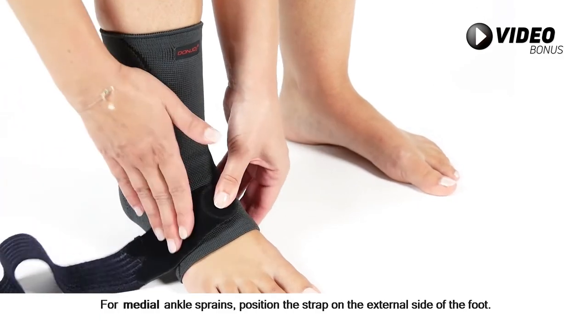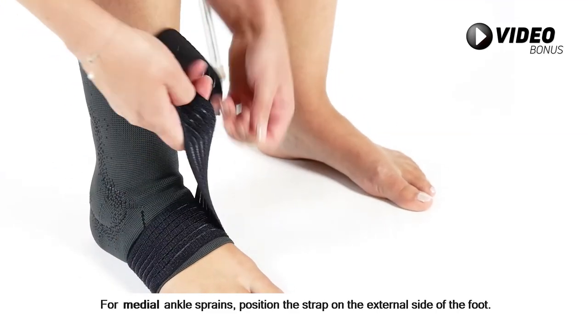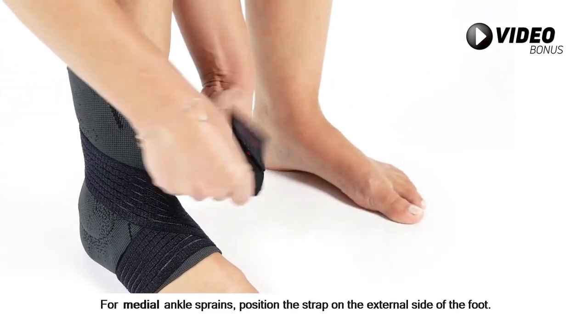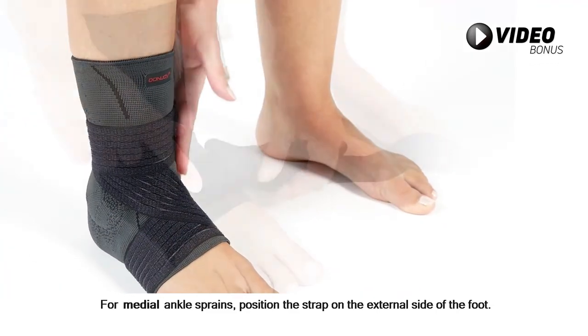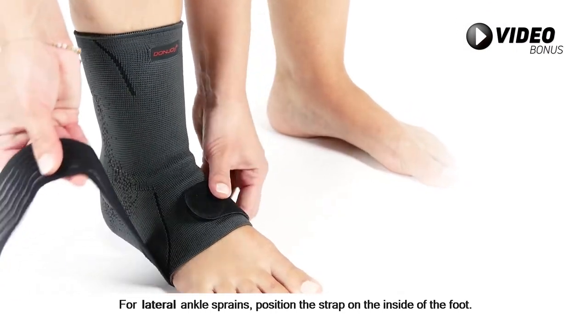For medial ankle sprains, position the strap on the external side of the foot. For lateral ankle sprains, position the strap on the inside of the foot.